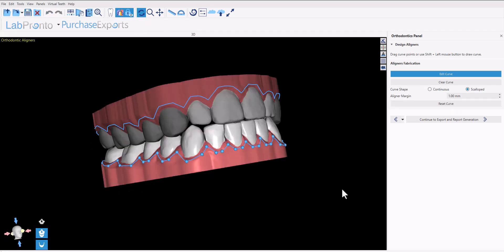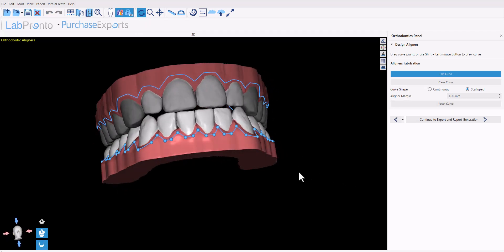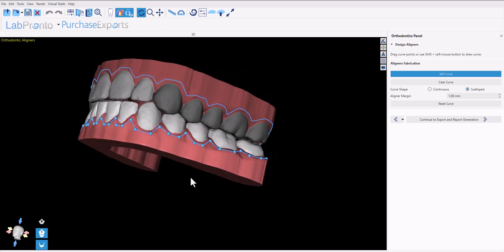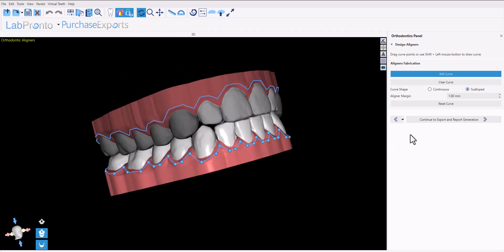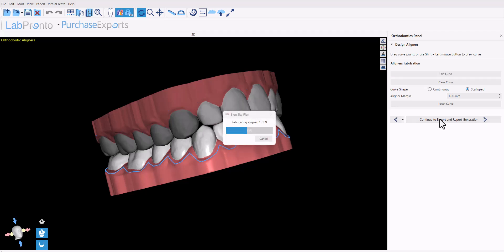Once you've finalized the aligner curve, click 'continue to export and report generation'. The software will now generate the files for each individual aligner.